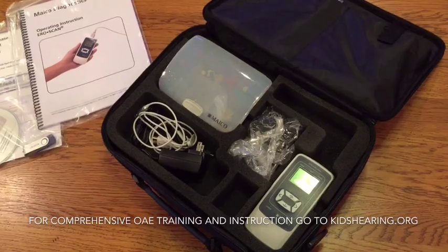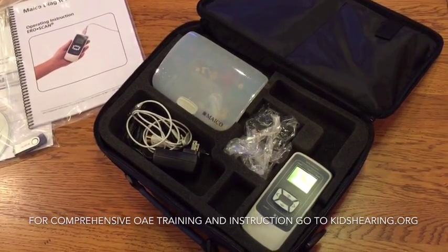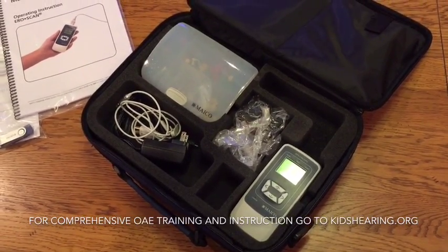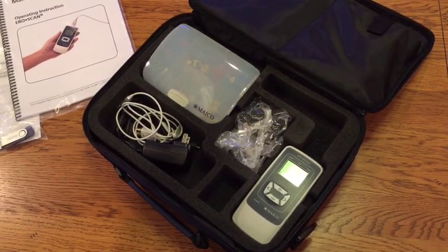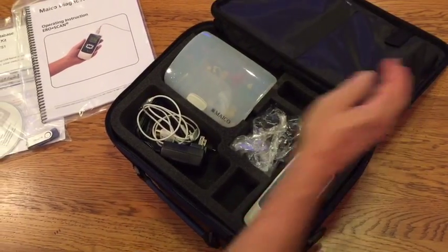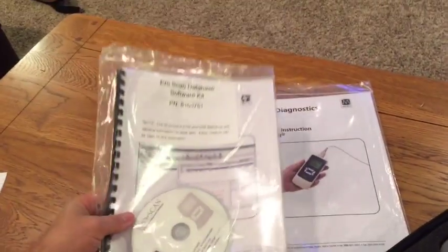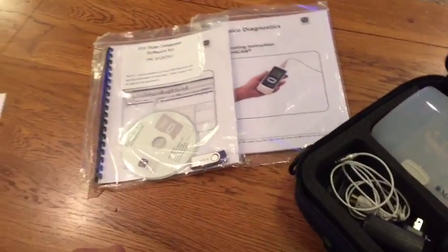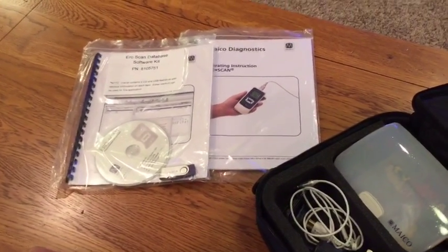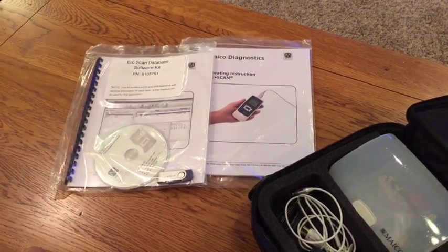This video is not intended to provide instruction on what OAE screening is or other screening program protocols or details. For detailed information on OAE screening in early childhood, visit kidshearing.org. The equipment comes with user manuals in either printed or digital form — you should review them and refer to them with questions. This video will provide the most important user elements to help you get up and running and start screening children quickly.